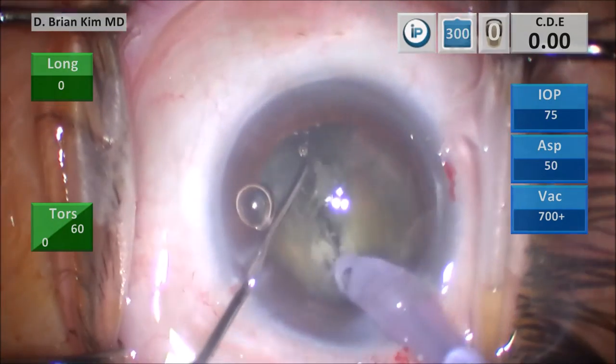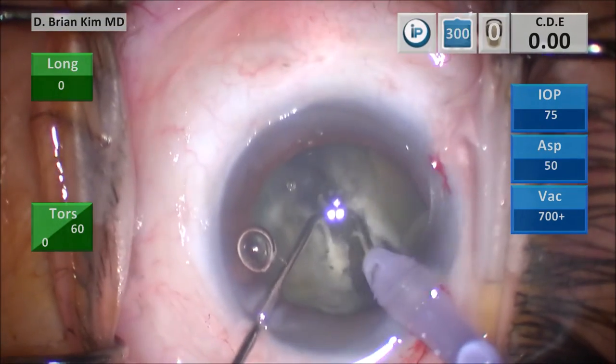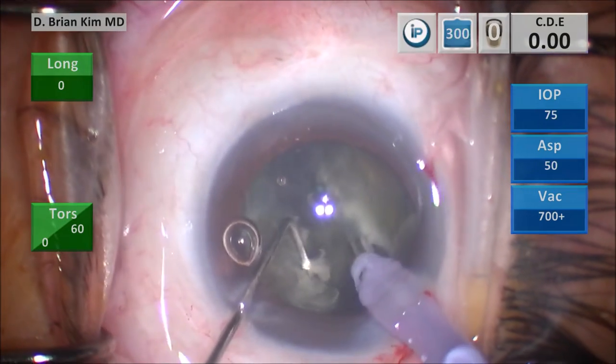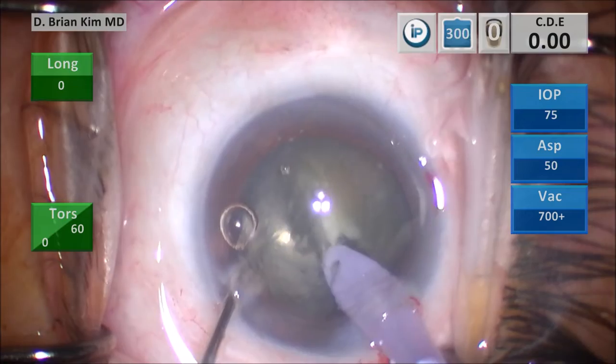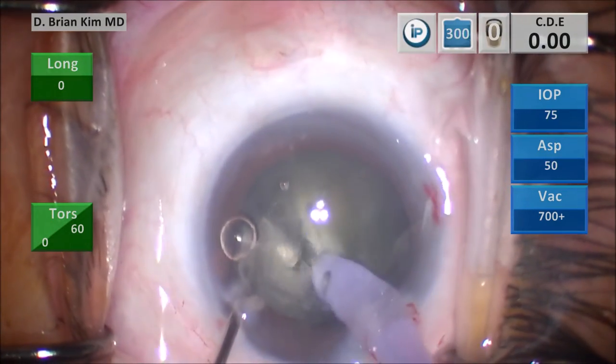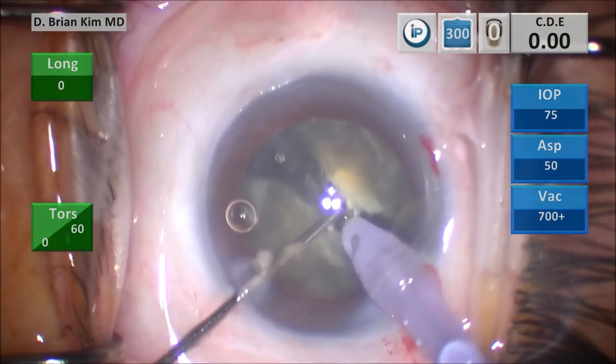I'm going to continue to perform some lateral separation to make sure that the chopper and the phaco tip have completely divided the lens material. There could be some posterior adhesions, which I believe there are here, and so I'm continuing to separate until you can see now that the lens is completely divided.